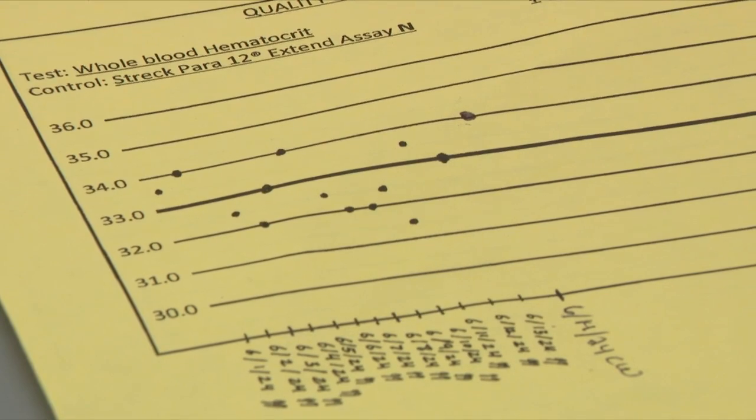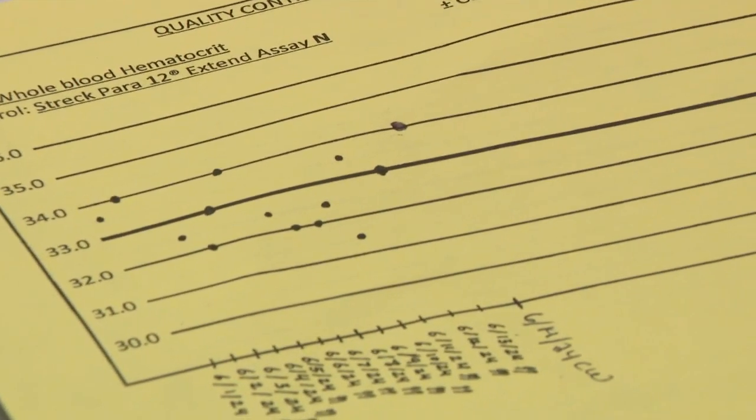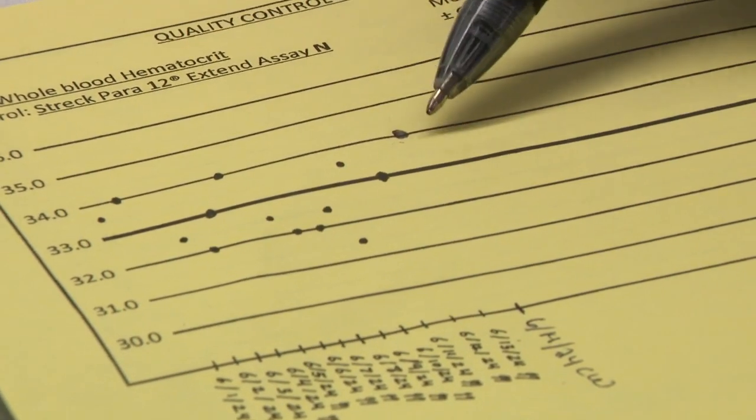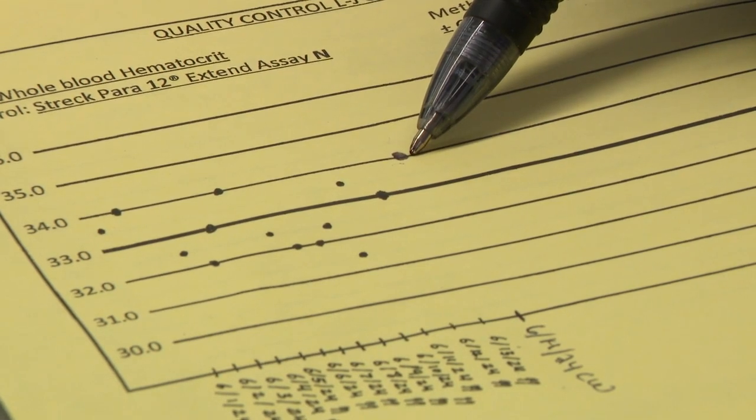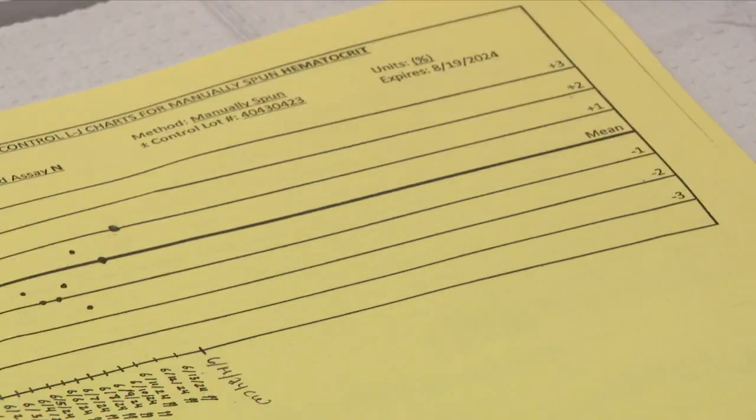Now we have to determine if our QC was acceptable overall. To do this, we're going to chart our value on the Levey-Jennings chart, which was 34 percent. And if our value is within plus or minus two standard deviations of the assayed control mean, then it is acceptable and we can report our patient sample hematocrit value.